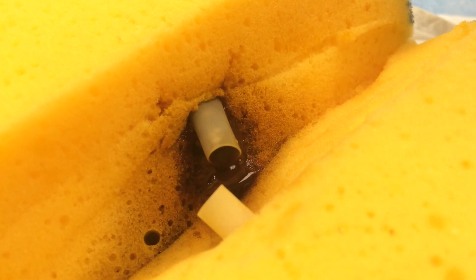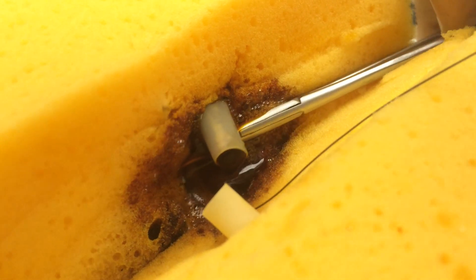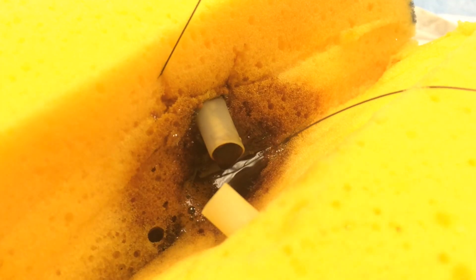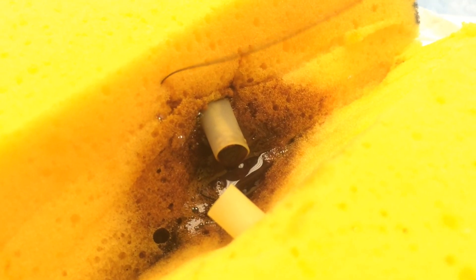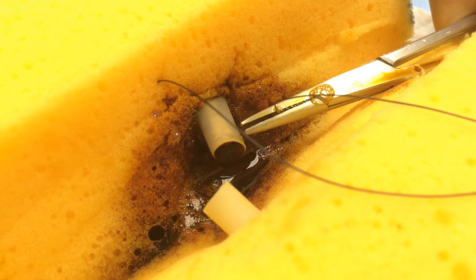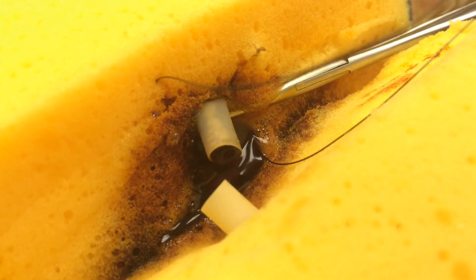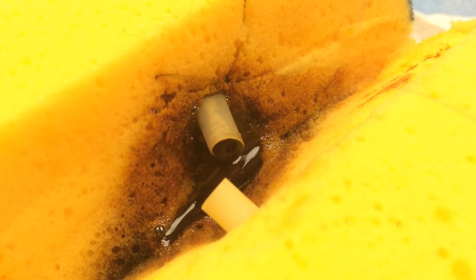Let's take a closer look at this technique. Another way to think about it: if you imagine a square box around the bleeding source, you're going to throw your figure of 8 suture such that the points of entry and exit of the suture are each of the corners of that box. You throw deep to superficial, reload your suture needle, and again throw deep to superficial on the other side of where you note the bleeding.